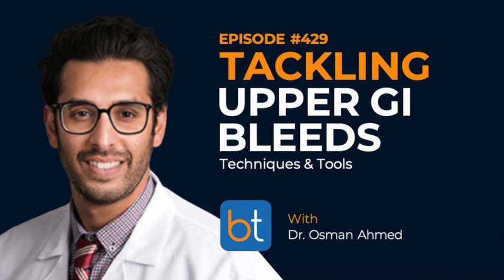And just a couple little technique things. Do you ever go radial access? Yeah, for me personally, I don't do a lot of radial. That's just our institutional culture. You certainly can. I think obviously there's a lot of radial first institutions, and the reality is probably for a lot of these cases, the angles might be more favorable coming from that approach. But for me personally, I don't do a lot of radial.